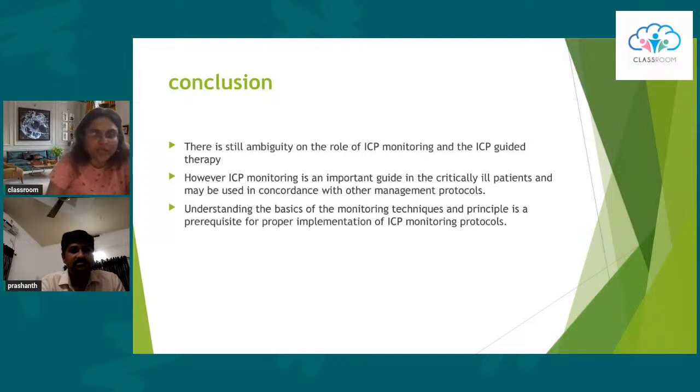Thank you, Prashant. Thank you for such a wonderful and very thorough discussion of ICP monitoring. I just have one question. Usually, we do ICP monitoring as a part of tier therapy to decide whether the patient needs to undergo a decompressive craniectomy. So, is there a role of ICP monitoring even after the decompressive craniectomy has been done?